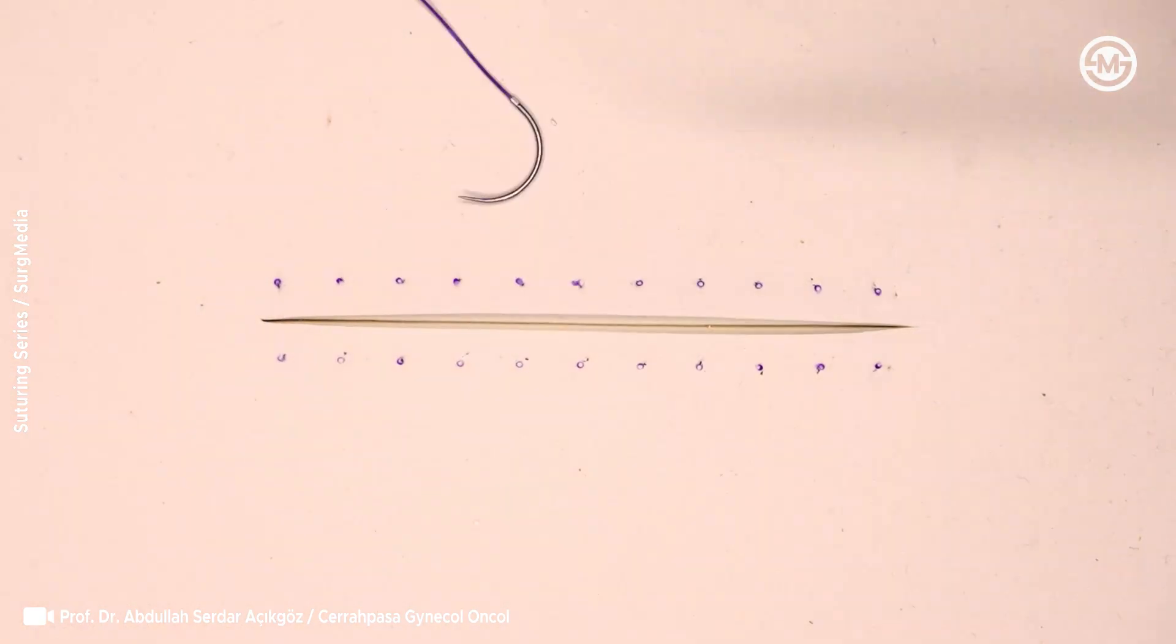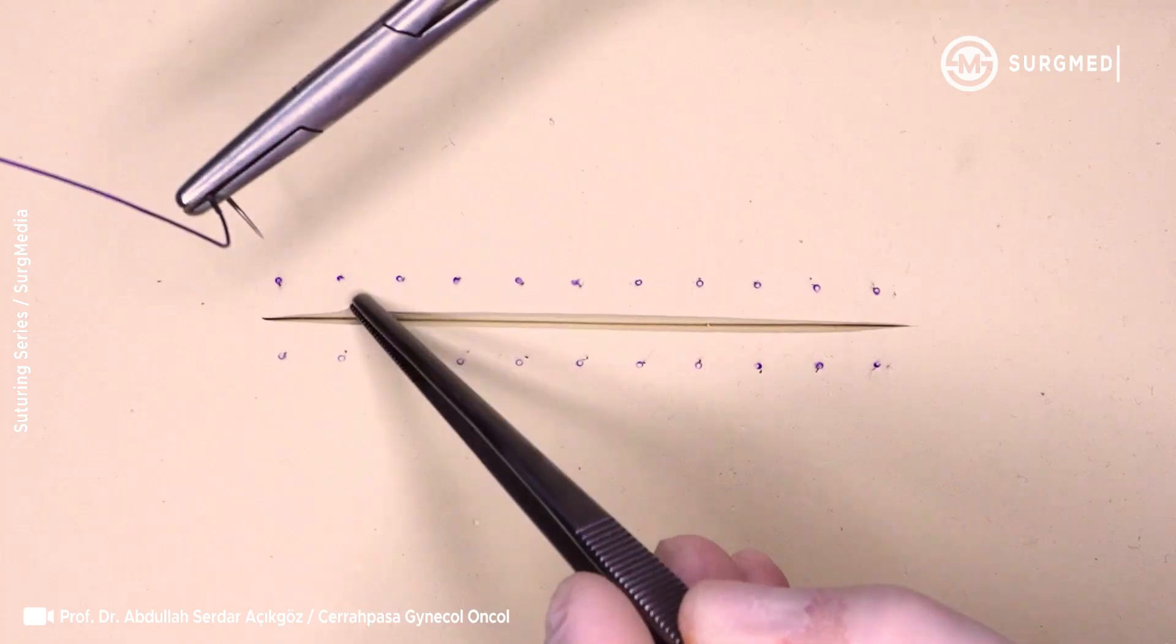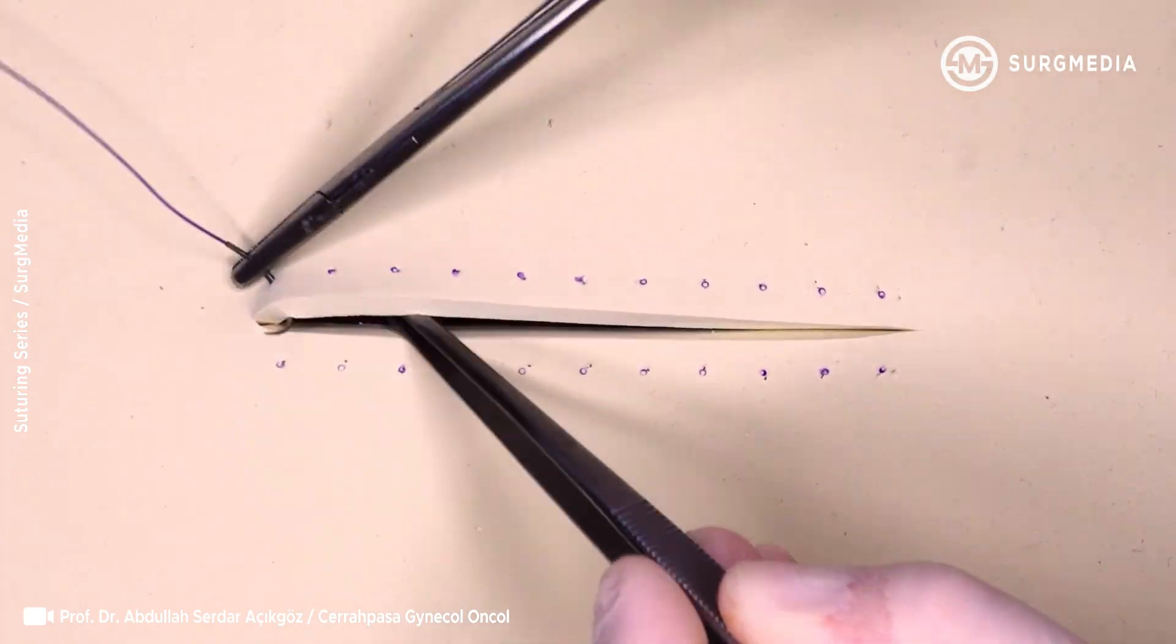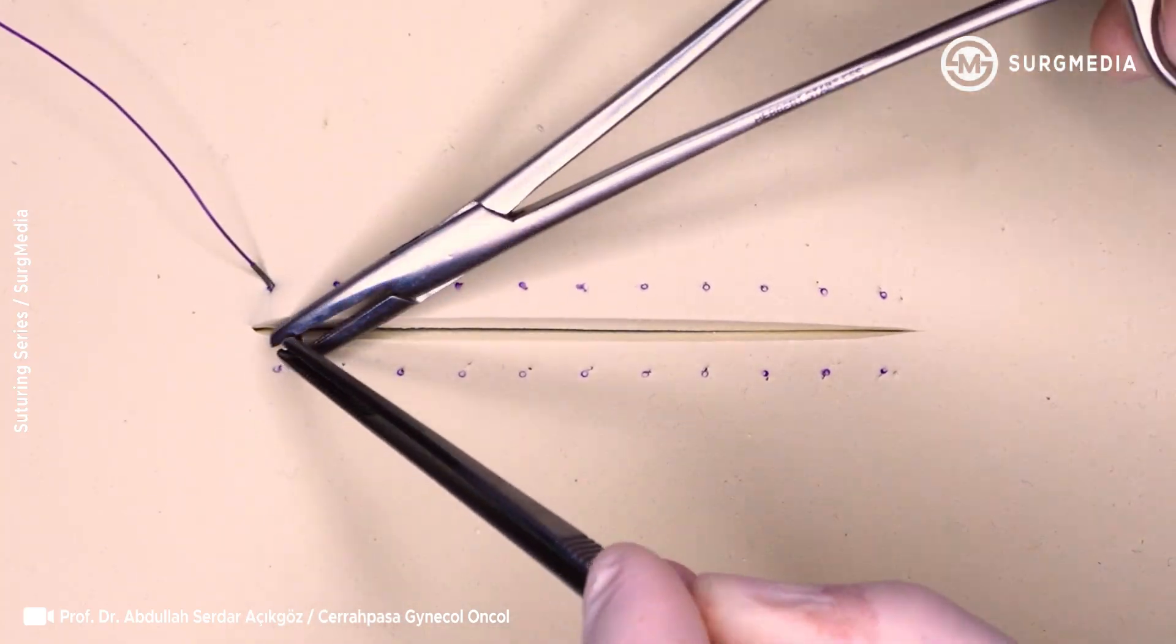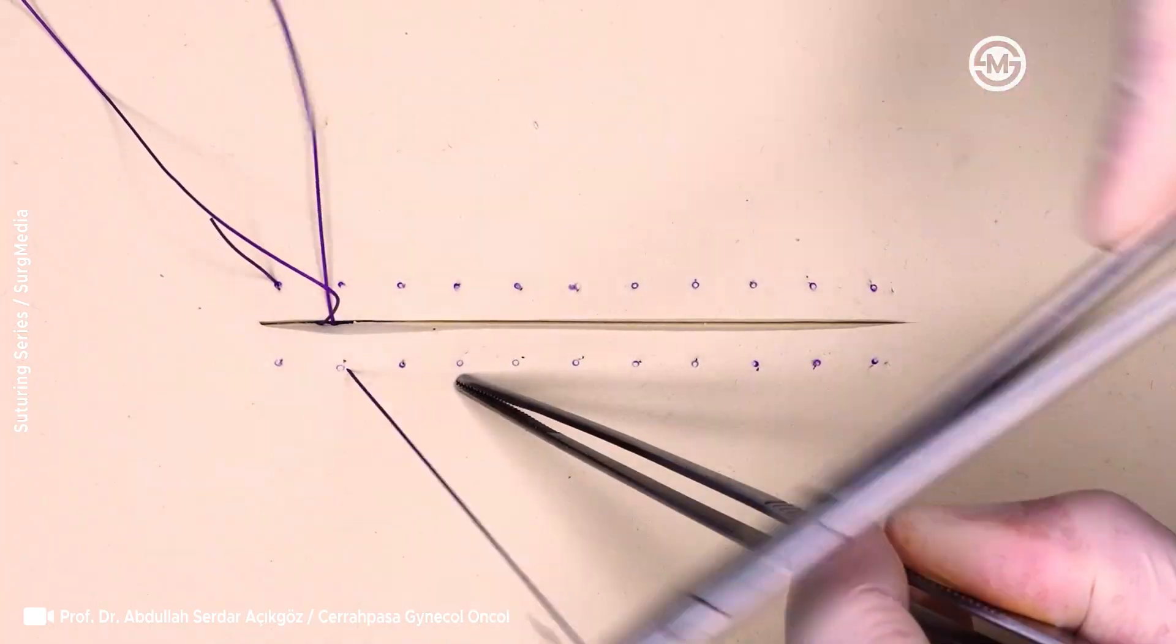In today's video, we're going to talk about the Hidden X-Suture, also known as the inverse figure of eight suture technique. As the name suggests, this technique is basically a reverse version of the classic figure of eight suture.